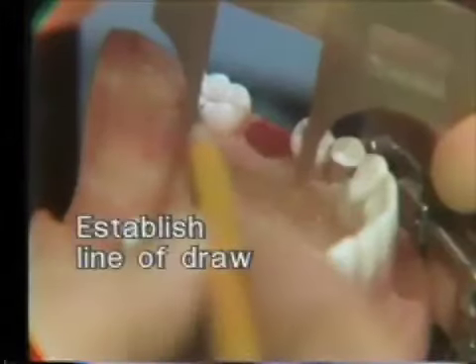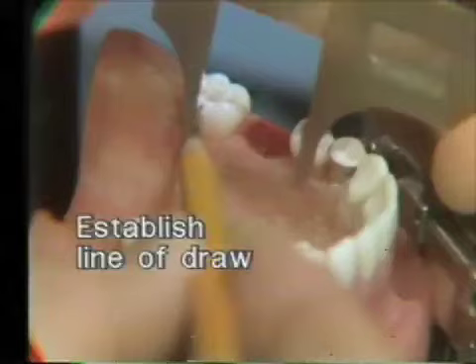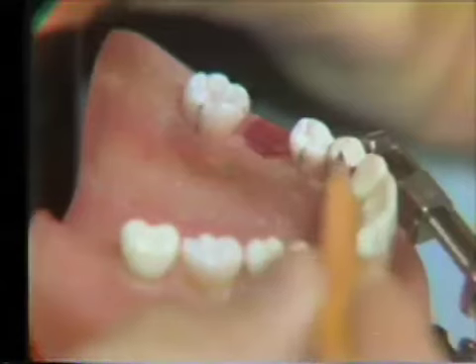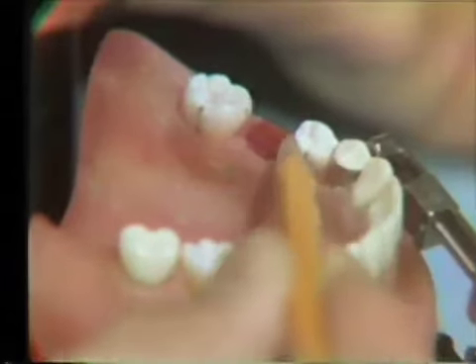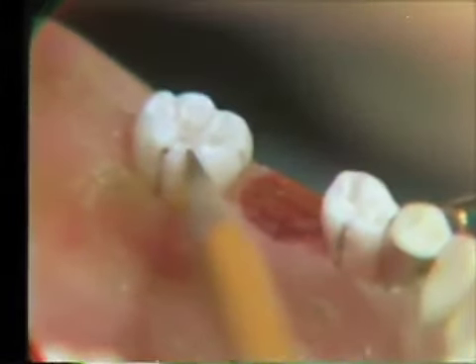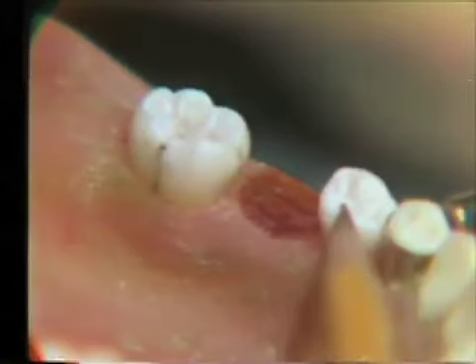The first step in the preparation of multiple preparations is the establishment of the proper line of draw. The mandibular first bicuspid is protected with an amalgam matrix, and pencil marks are placed where the tracer cuts are going to be prepared on the molar and the bicuspid. Now both of these preparations will be prepared at the same time.